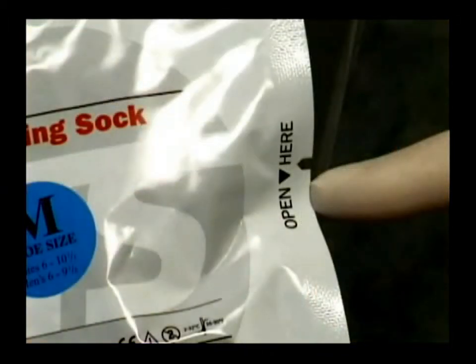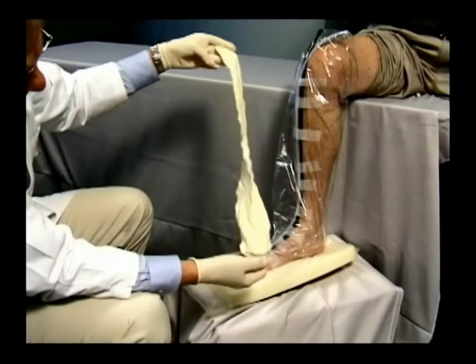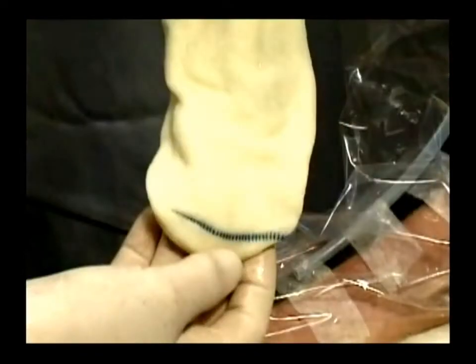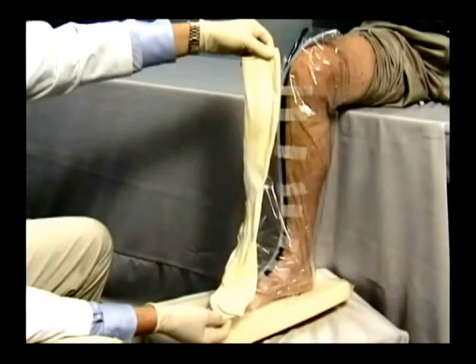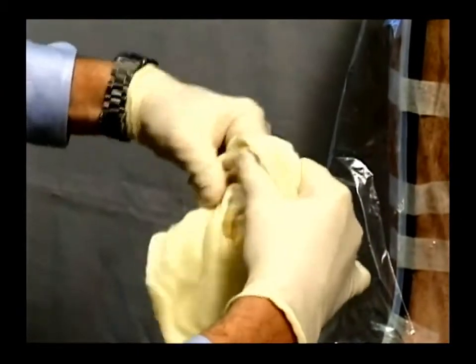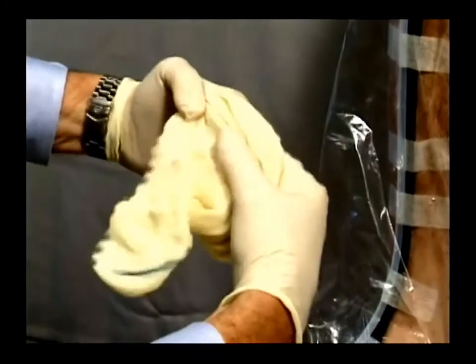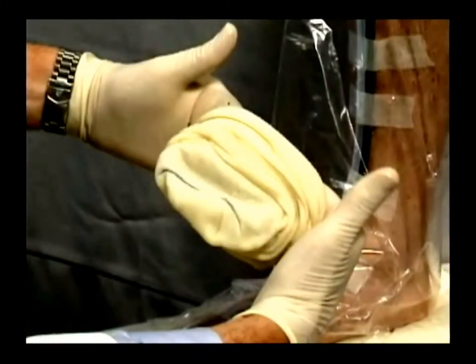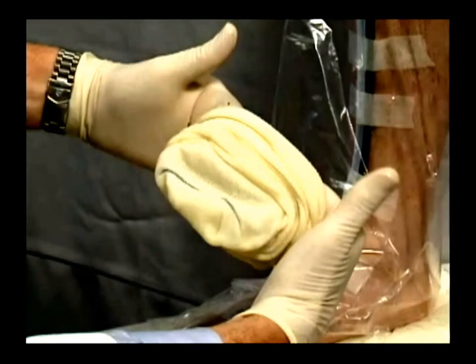Using the tear notch provided, remove and completely unroll the resin coated sock. The STS mid-leg sock is a fitted polyester sock with a defined toe and heel portion. A colored stitch line easily identifies the toe end; this color will vary depending on the size of the sock being used. Let the sock dangle downward with the toe end toward the floor and the colored stitch line facing you. This will automatically position the heel of the sock facing away from you. Gently gather up the sock using both hands, keeping the stitch line oriented toward you, all the way to the stitch line. During the gathering process, keep the stitch line facing toward you and the heel facing away from you. This will ensure that the heel pocket of the sock is positioned correctly. Be careful not to stretch out the material too much during the gathering process.